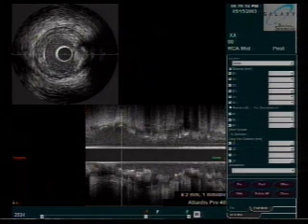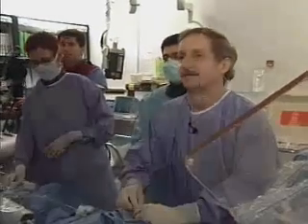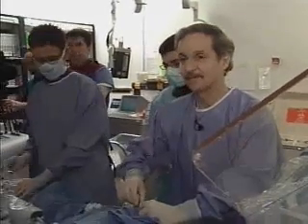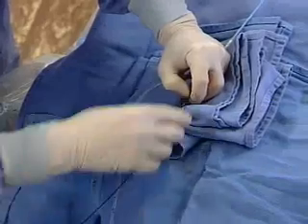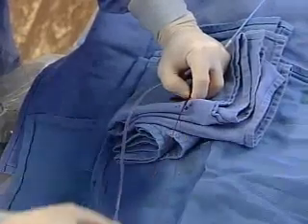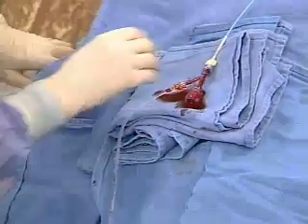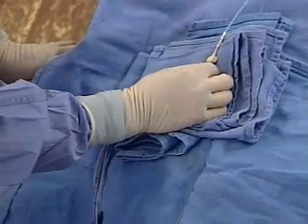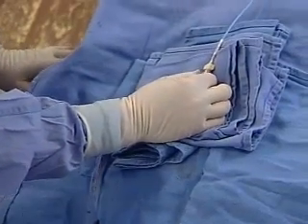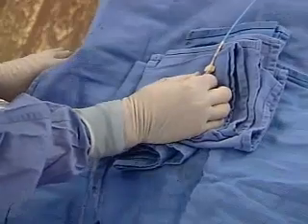Bill, can we go live to you and maybe you're going to pull that wire out and show us the final picture? Is that your plan? I think you're just about done here. Yes, we are. You made it look pretty darn easy, Bill. Pulling the wire out, pulling the IVUS out, and we'll set up for the final picture here. We are quite pleased with the results. He should be able to walk his dog on the lakeshore without any discomfort. So we've got the catheter in, just taking our final picture.